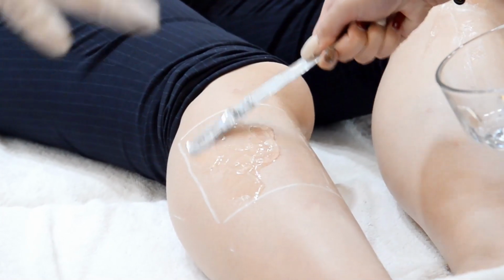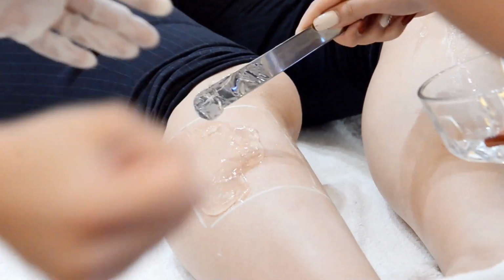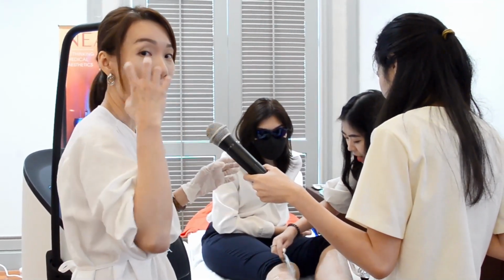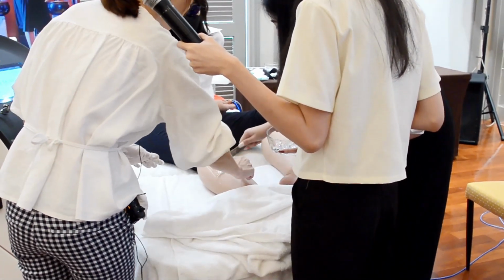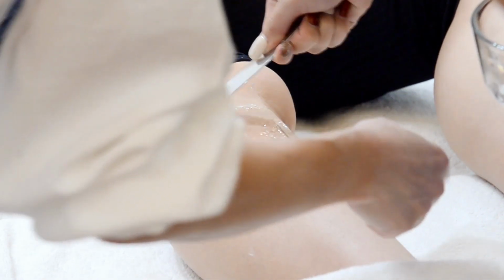As mentioned, we do not need to apply a lot. The purpose of this gel is to help you glide the handpiece across the treatment area. Unlike the Cephiro that you saw yesterday, where I apply very thick because I need the gel for the absorption and penetration of the light, this one is more of just helping you glide the device. No need so much. Just move it over the area. Even this area, even the white line.